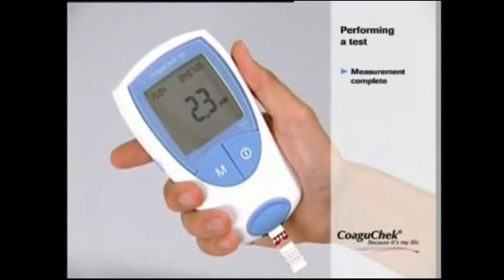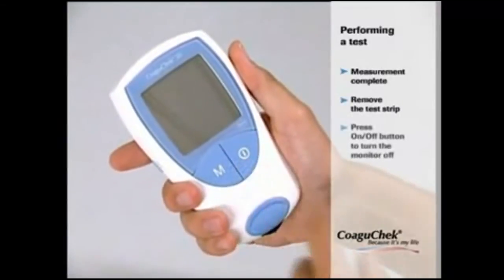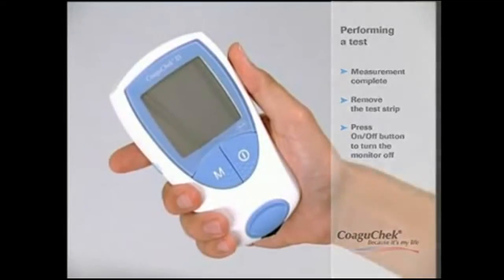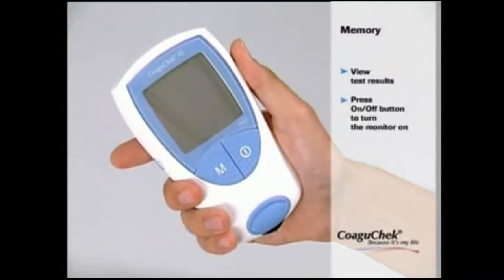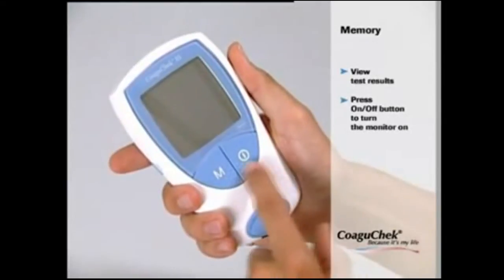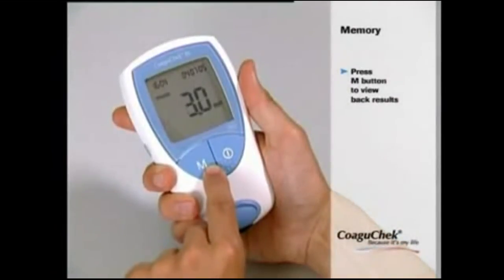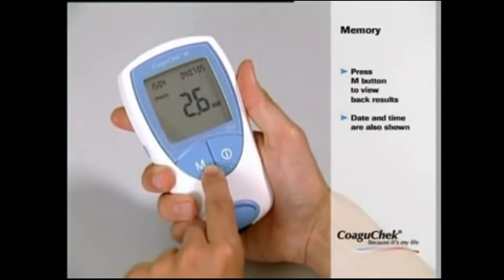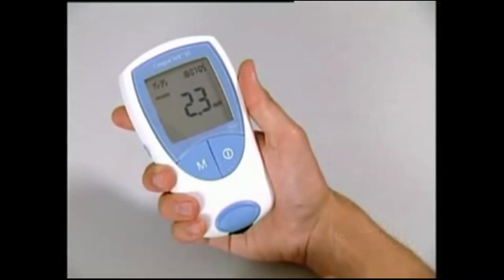Congratulations — you have successfully completed the measurement. Please remove the test strip and press the ON-OFF button to turn the monitor off. If you wish to view the last results, press the ON-OFF button to turn the monitor on again, or press the M button to directly enter memory mode. To view back results, press the M button. Date and time are also shown, making it easy to enter results in your coagulation diary and for your doctor to interpret the values, ensuring your therapy is optimally geared towards your needs.